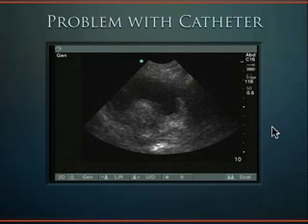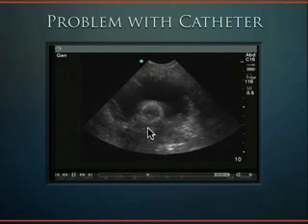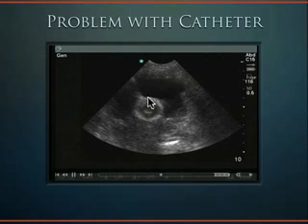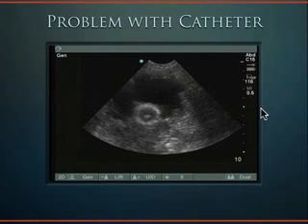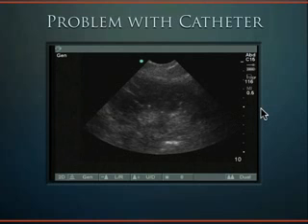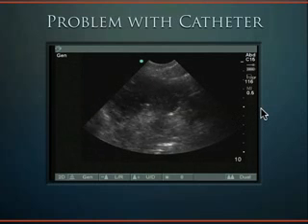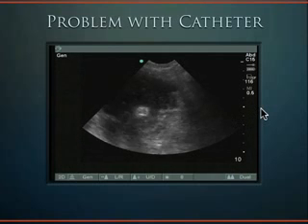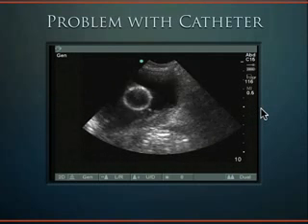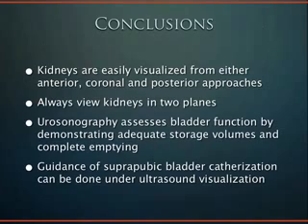So we went back in the room, and here we can see his balloon here, and I thought about the suprapubic bladder, everything, and so I brought a needle down under ultrasound guidance, and I got on that balloon, see the needle on the balloon there, and then boom, we popped it, and then we were able to take the catheter out, and we put a new catheter in there and flushed out all those pieces of balloon particle that were floating around in his urine, and got it out of there. But so that's the idea. That's the clinical correlate I wanted to leave you guys with.